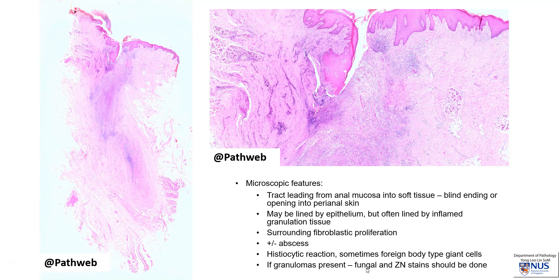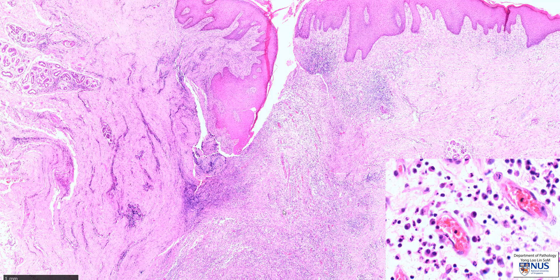If granulomas are present, then fungal stains as well as Ziehl-Neelsen stains should be done to look for microorganisms. Here is a higher magnification picture showing the opening of one of the ends of the tract, and we can see the granulation tissue, which is composed of very small, delicate blood vessels and lots of surrounding edema and inflammatory infiltrates.